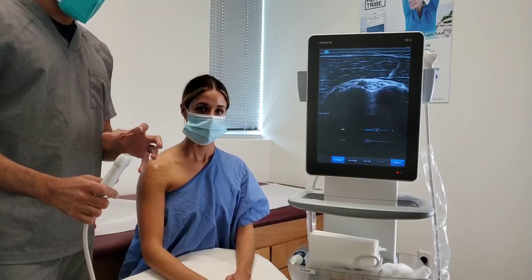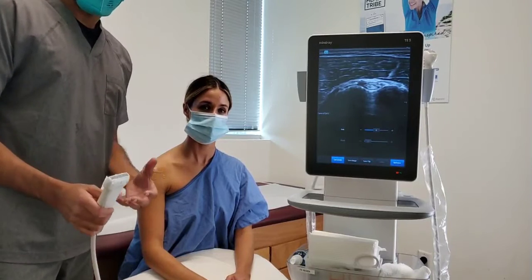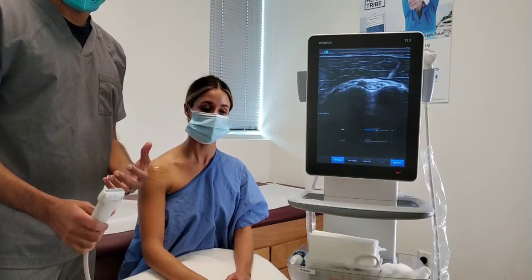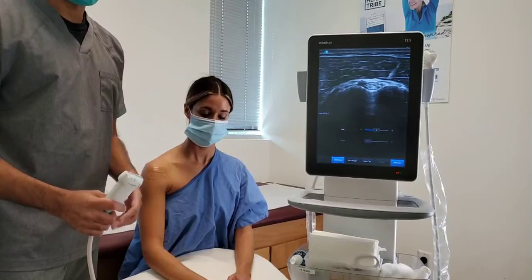The shoulder is actually interesting. MRI is great at looking at particular structures. Ultrasound is actually more sensitive at looking at things like rotator cuff tears and biceps tendon issues, various different things like that. This can actually pick up a little bit more in terms of details with that.